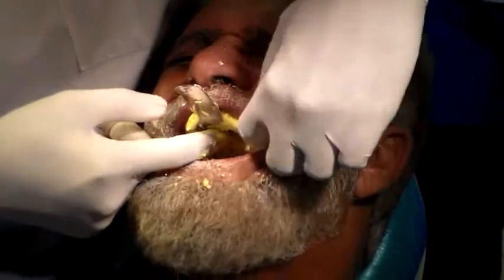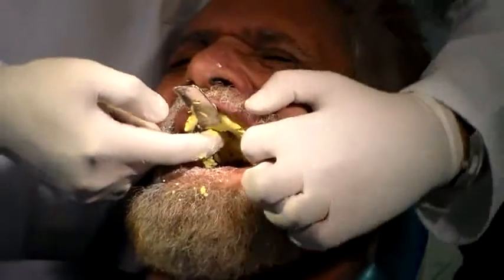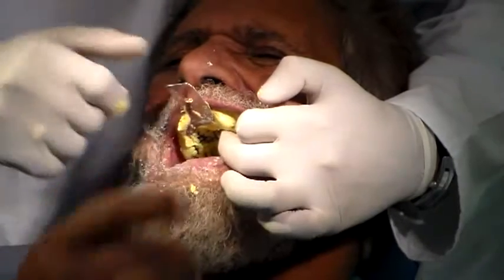Molding it until it sets, and once it is set, you want to take it out with a snap-jerk motion — not slowly teasing it out, because if you slowly tease it out, it tends to distort the material.